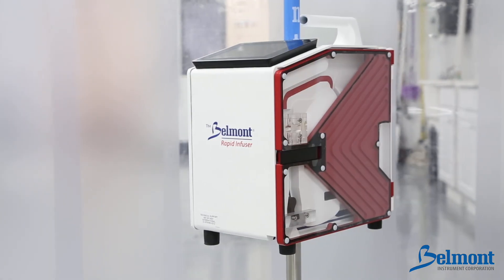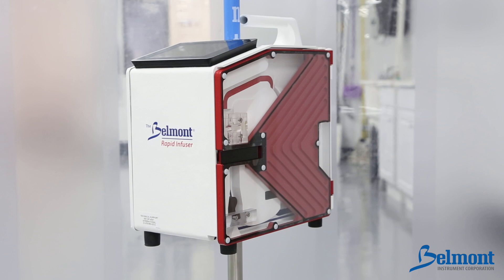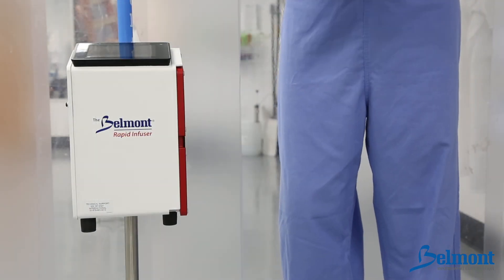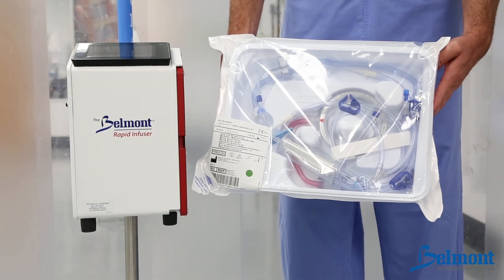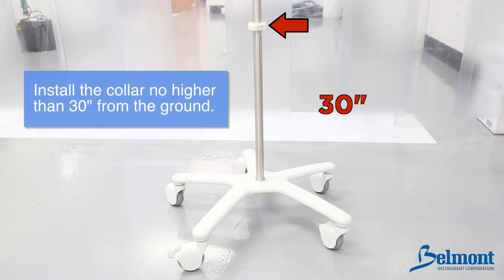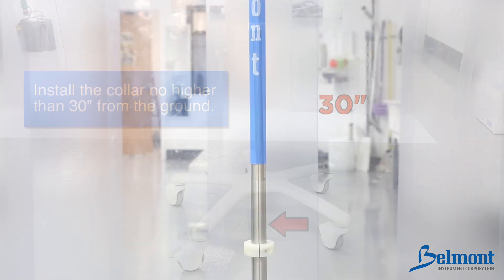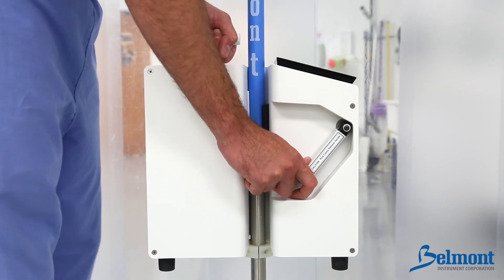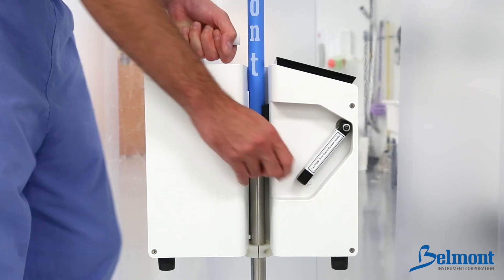The Belmont Rapid Infuser RI2 consists of two main components: the control system, which is mounted on an IV pole, and the disposable set. First, install the collar on the IV pole just beneath the system, no higher than 30 inches from the base of the IV pole. Mount the system above the collar by pushing down on the pole release handle. Check that the system is secure before proceeding.